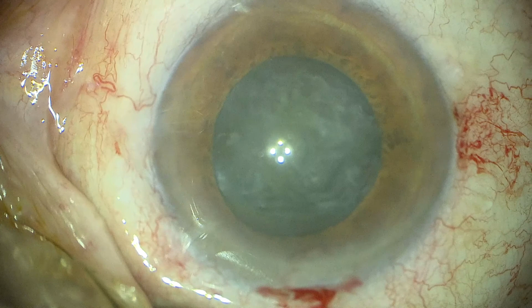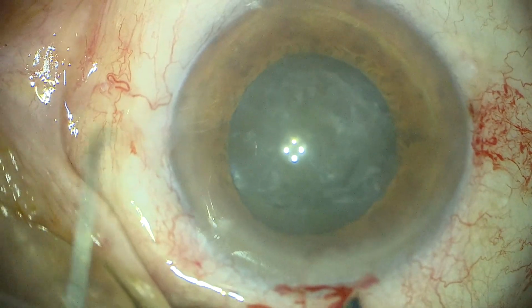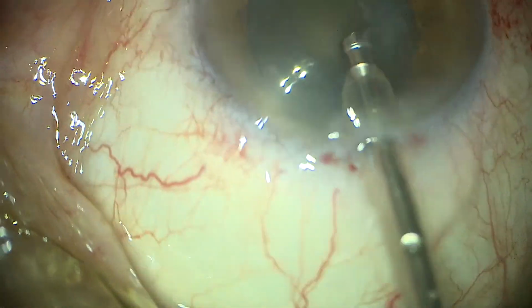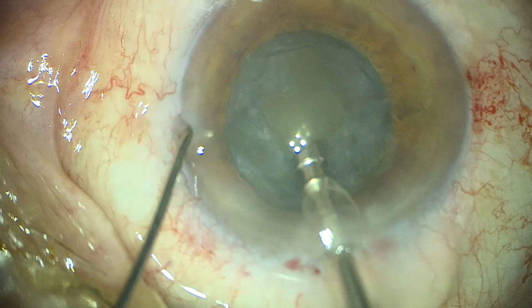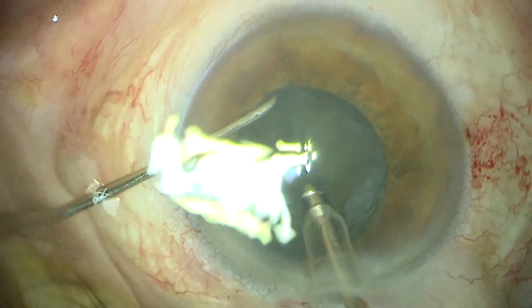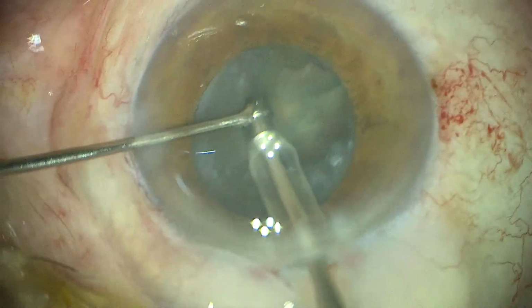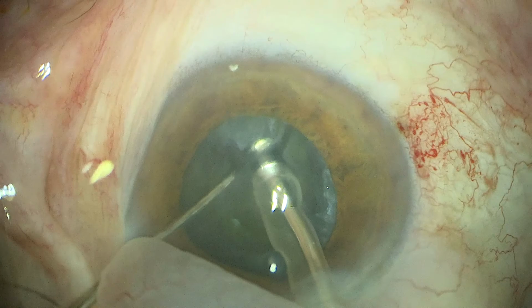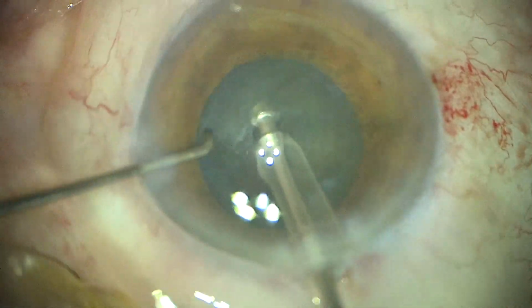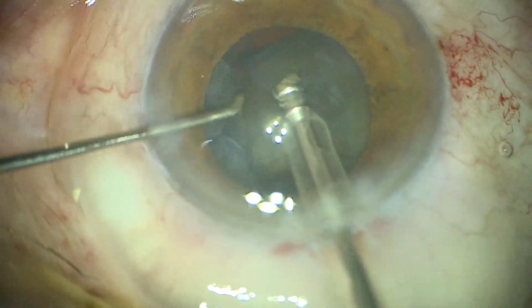So we try to do as much hydrodelineation and hydrodissection as possible to separate the entity of the nucleus from the capsule. That way we can manipulate the nucleus without exerting force on the capsule itself. We try to rotate the nucleus, it's not always possible, and then we perform chopping, pushing the nucleus equator to the center and never to the periphery, and try to levitate the sectors separately into the anterior chamber where they can be phacoemulsified easily without transferring unnecessary energy downwards to the capsule area.